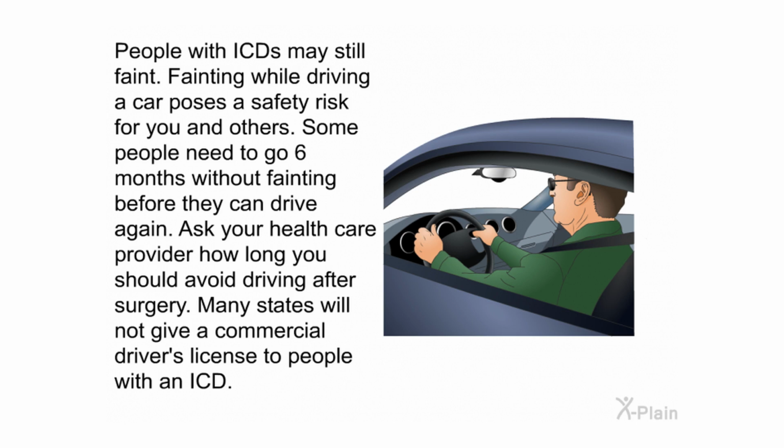Fainting while driving a car poses a safety risk for you and others. Some people need to go 6 months without fainting before they can drive again. Ask your healthcare provider how long you should avoid driving after surgery. Many states will not give a commercial driver's license to people with an ICD.